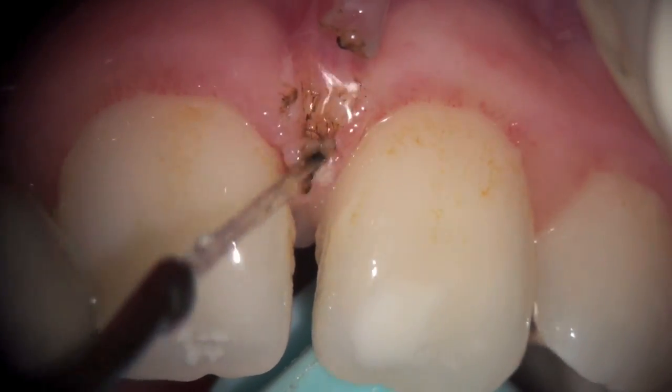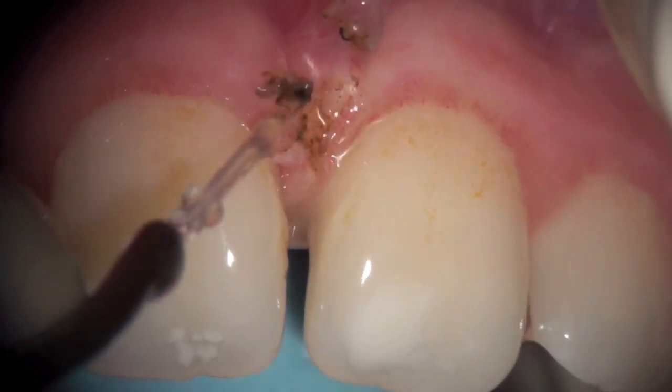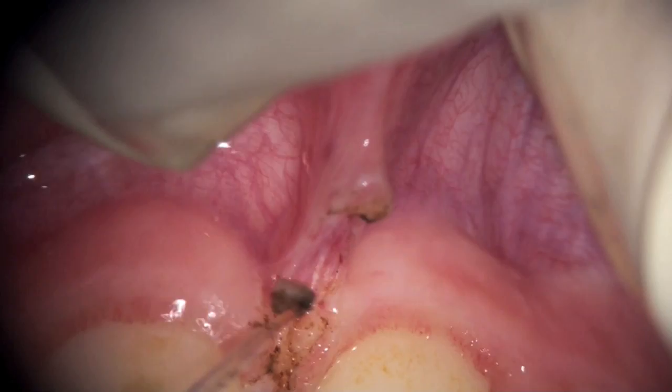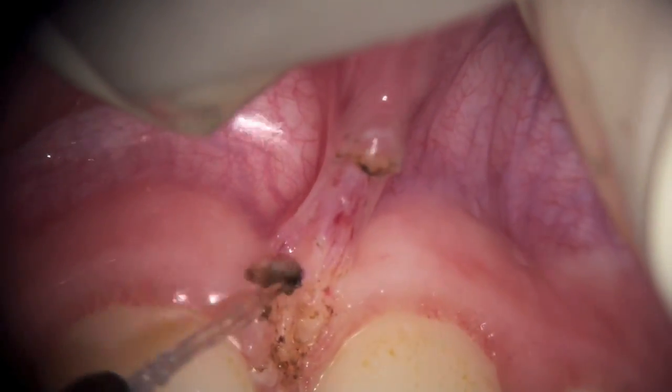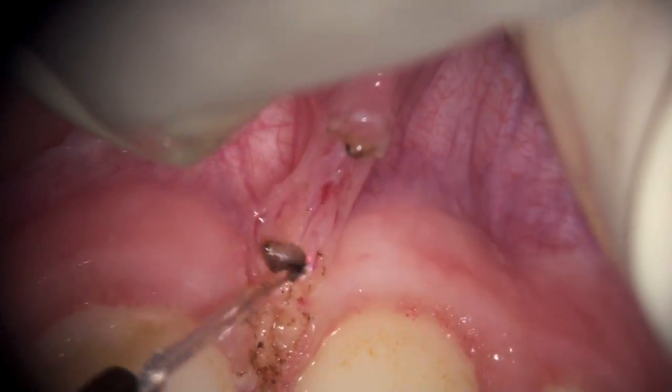I try to use the laser to superficially remove some of the fibers that are running in between the two teeth here. Now you can see that as it's releasing the fibers — with the upper lip pulling and with the right hand — we're slowly creating a diamond-shaped open wound.